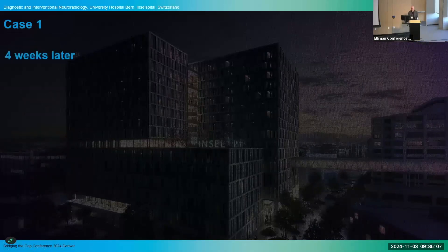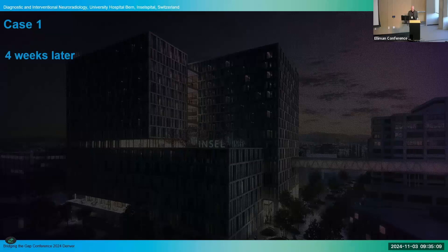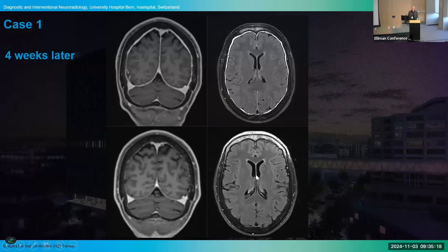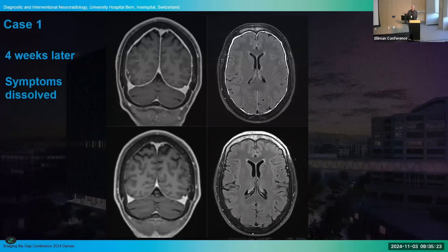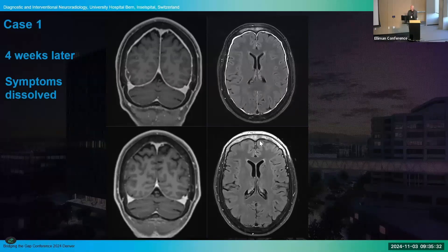We bring all patients back for clinical visits and MRI four weeks later. You can see the MRI brain normalized and symptoms resolved. This is the only imaging-proven sign we have that the fistula may be occluded. It's a problematic point for CSF venous fistula because we cannot directly prove that the epidural fluid is gone — we have to rely on clinical findings and brain MRI imaging signs.